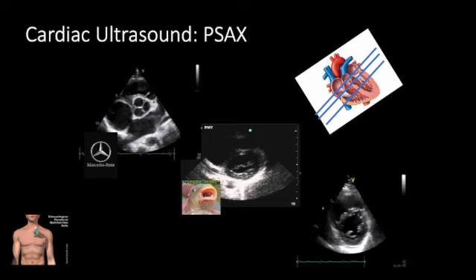It's probably a pretty synced, good electric circuit within the heart, providing the signals that the heart needs to be able to contract well. Looking at all of these levels gives us the best understanding of how the heart's contracting. And it helps us best evaluate the anatomy of the left heart valves as well, which can be implicated in a variety of cardiac conditions.